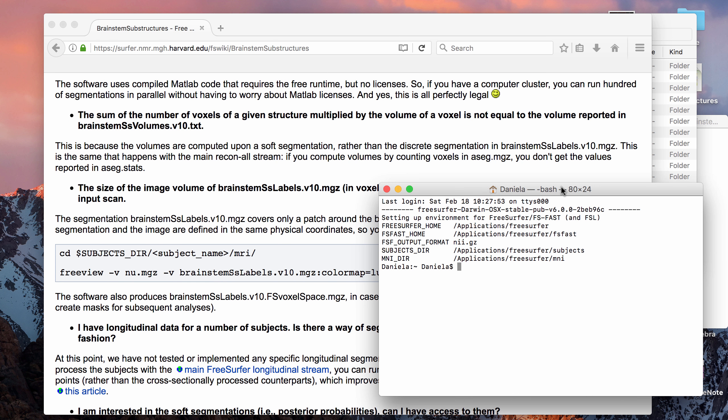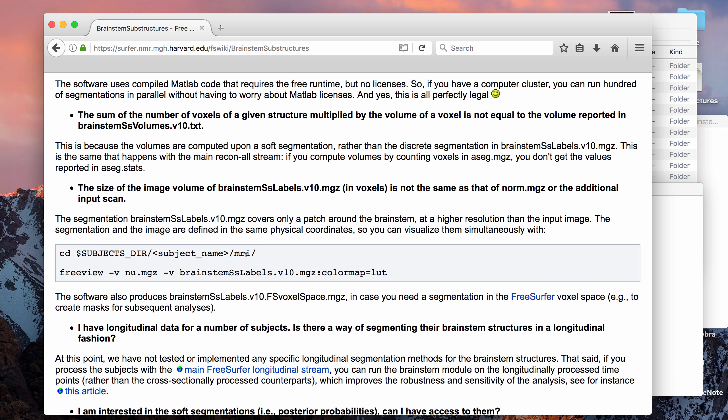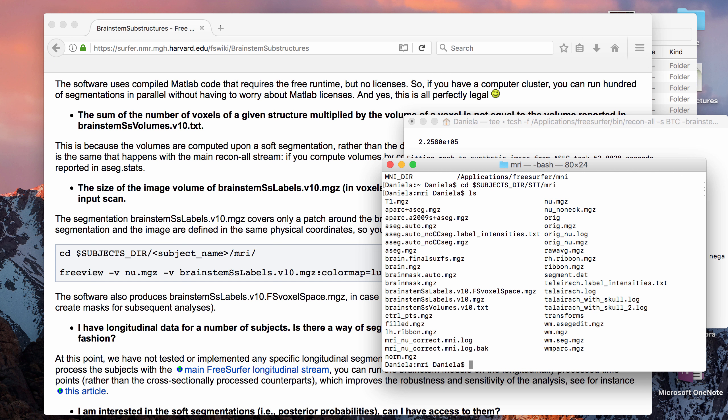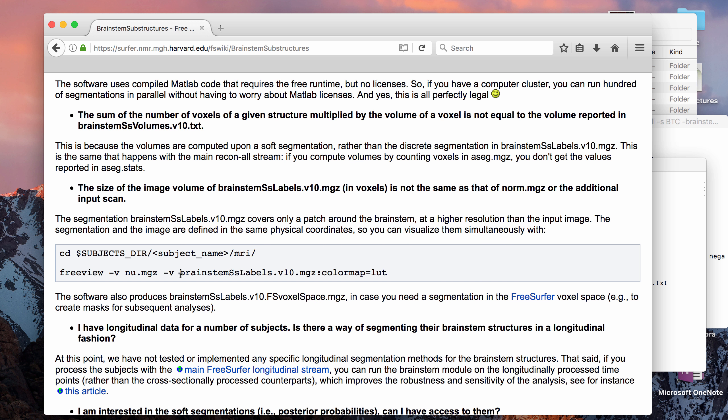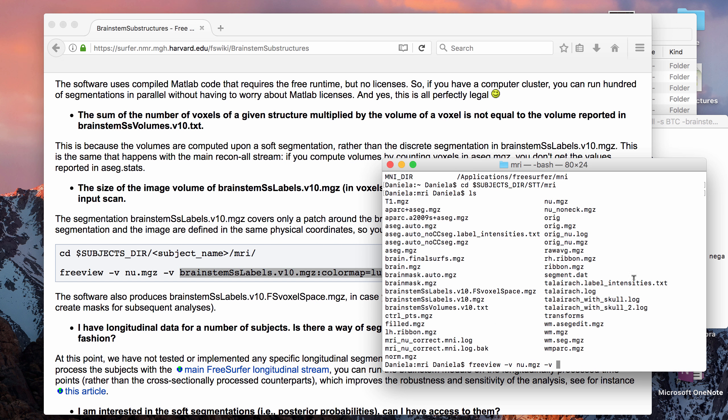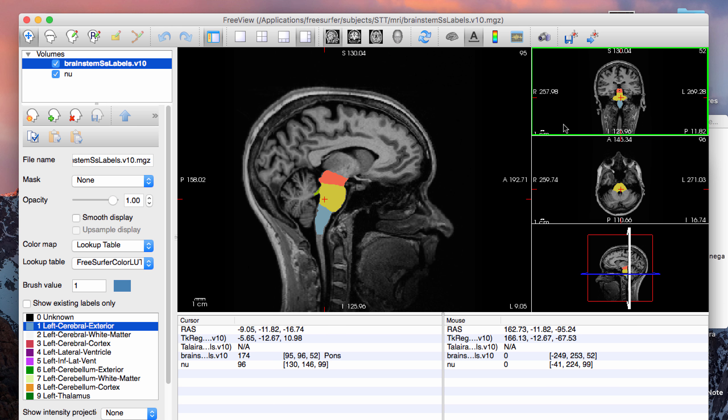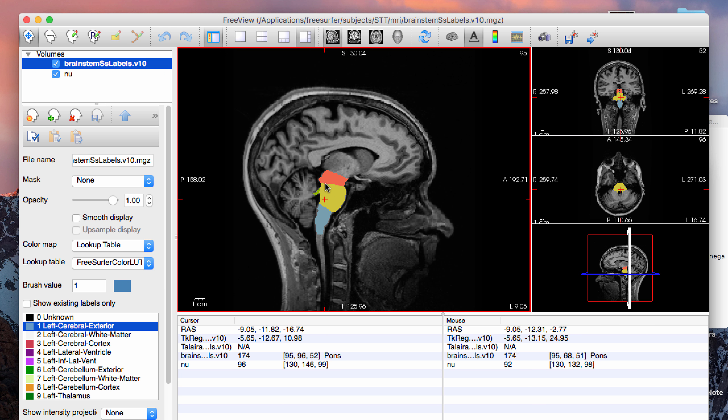If you want to view what the labels look like, then you can open it in FreeView and the code example is here. So I'm just going to cd to my subject directory, and then the subject name is STT, and then MRI. So we're going to open up FreeView with the nu.mgz file, and then I'm just going to copy and paste this code for the color map. Okay, so that opens up FreeView and if you can see, there are basically four substructures that it recognizes.